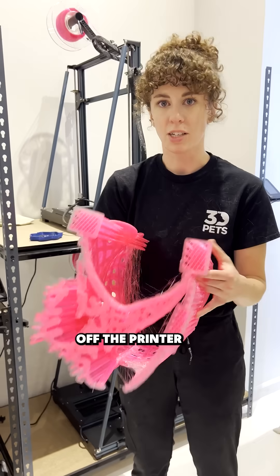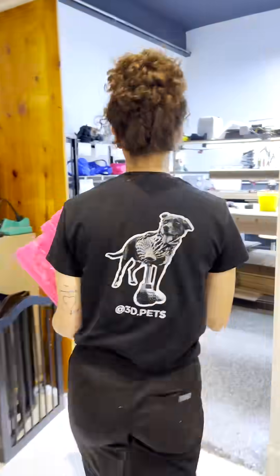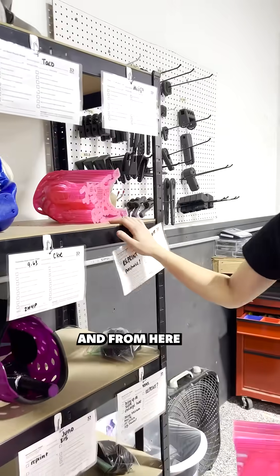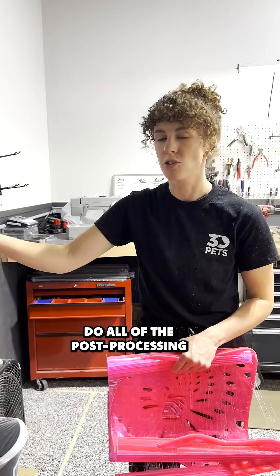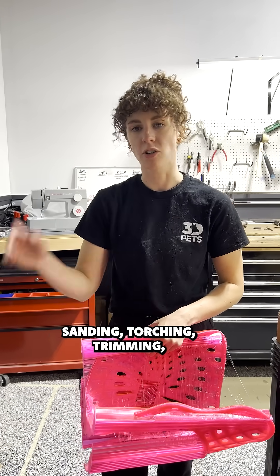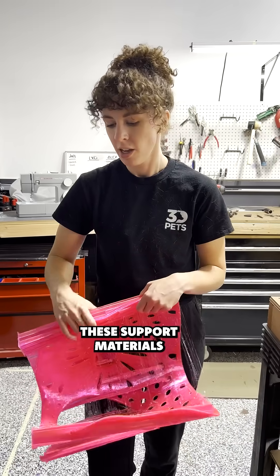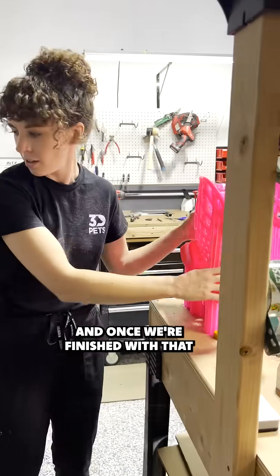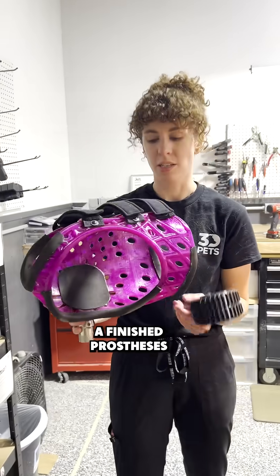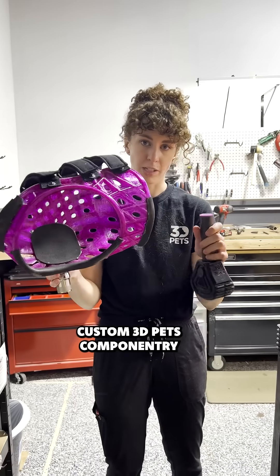Once we get the harness off the printer, we bring it back into our shop, where it goes into our build queue. From here, we're able to take the jackets and do all of the post-processing work, which includes sanding, torching, trimming, and removing all of these support materials. And once we're finished with that, we can put together the finished prosthesis with all of our custom 3D Pets componentry.